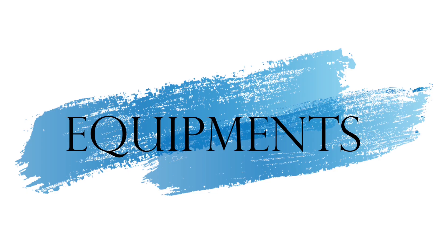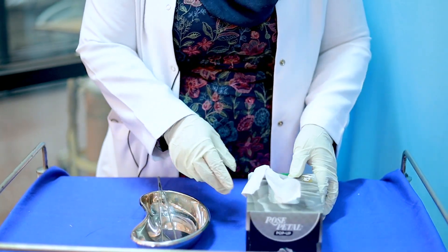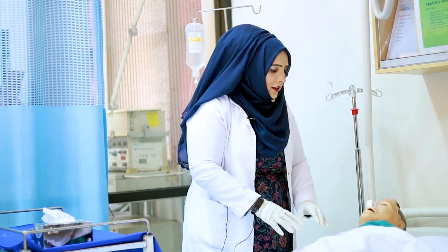The purpose of this procedure is that usually after an operation we remove the nasal packing. For the equipment, we need a receiver and tissues.